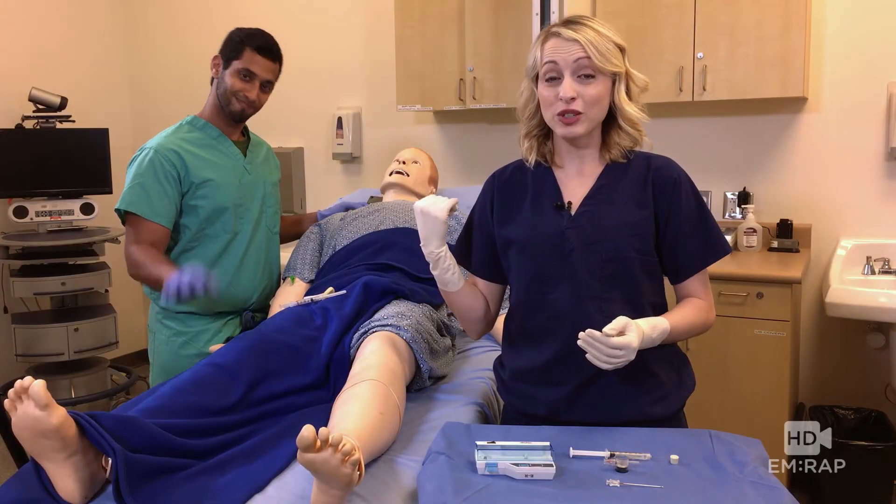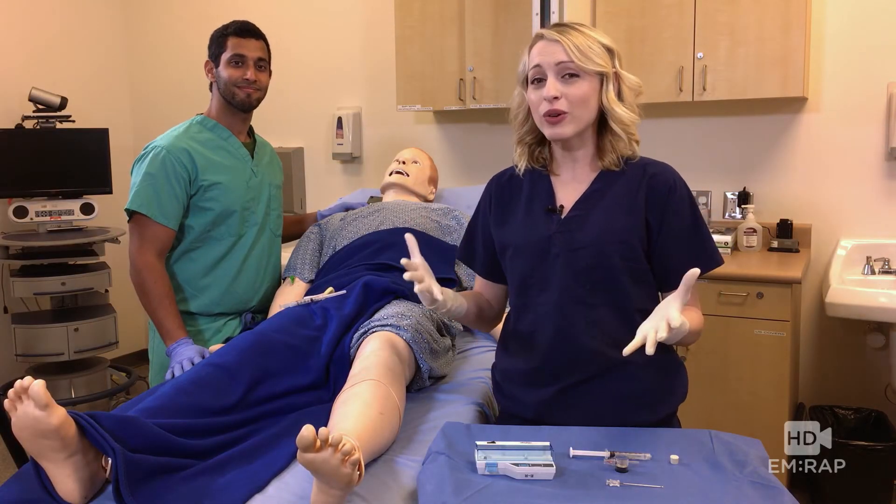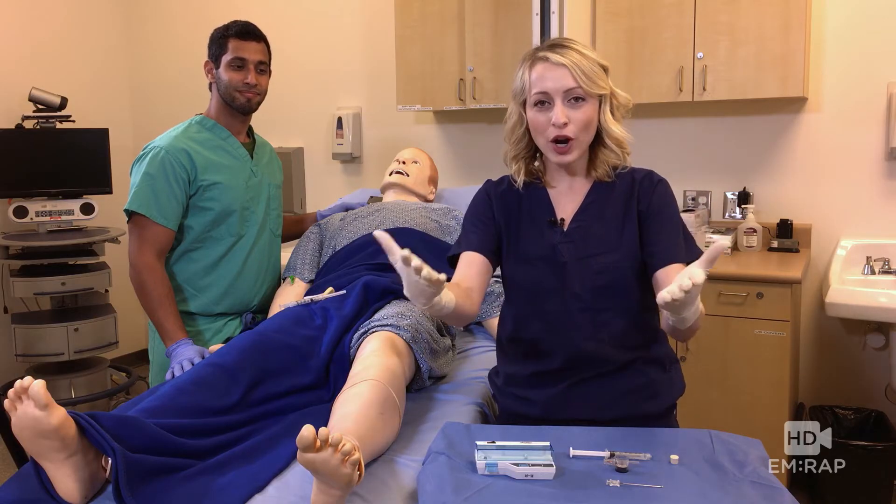I'm Dr. Jess Mason and this is Dr. Waleed Hamoud, and we are going to show you how to check compartment pressures.